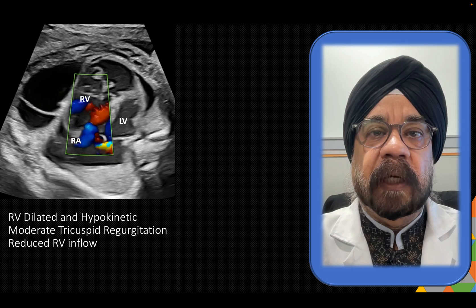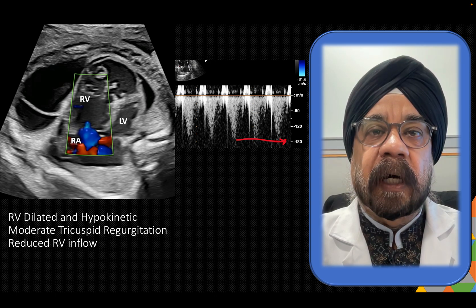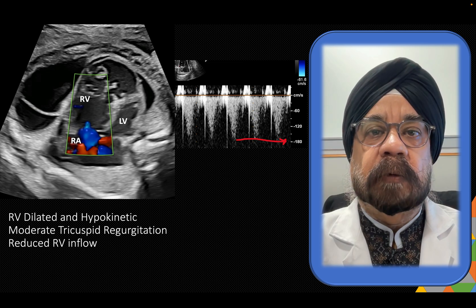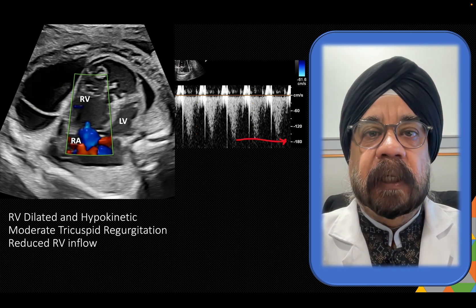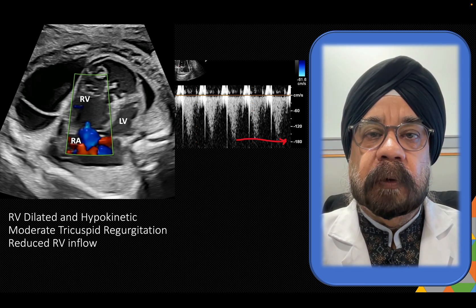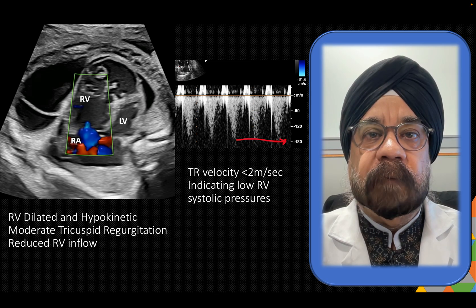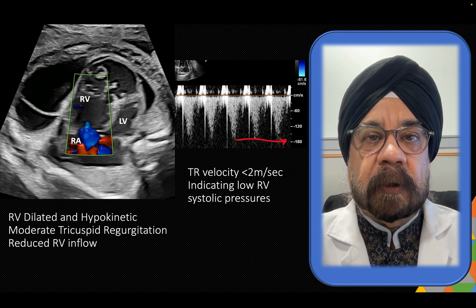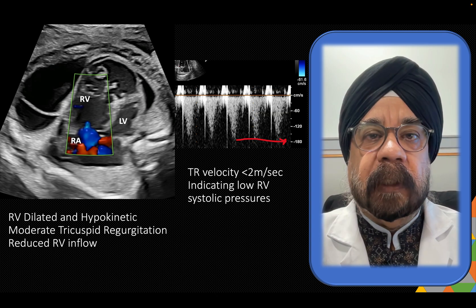In the same case, we measured tricuspid regurgitation velocity, and if you see it, it is hardly two meters per second. That means the RV is unable to generate pressure. This essentially rules out obstruction in the RVOT or ductal restriction — in my previous YouTube case the TR velocity was very high. A low TR velocity tells you the RV is unable to generate adequate pressure, meaning RV pressures are low. This tilts the entire approach towards RV dysfunction rather than anything else.